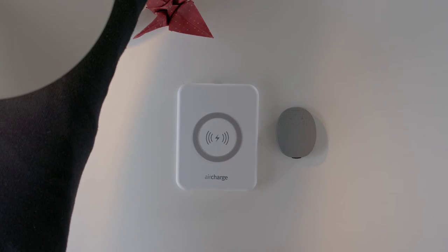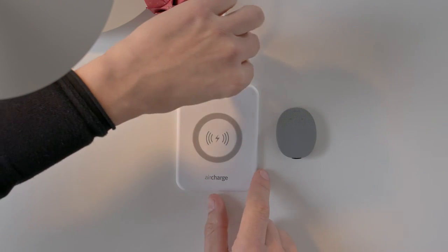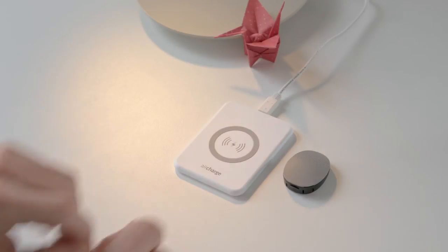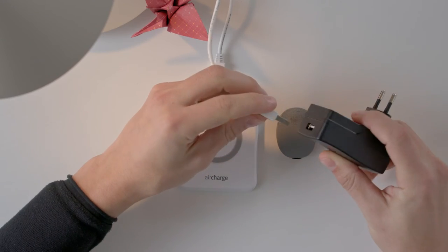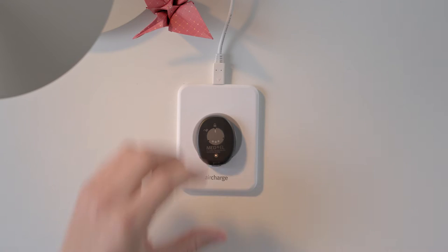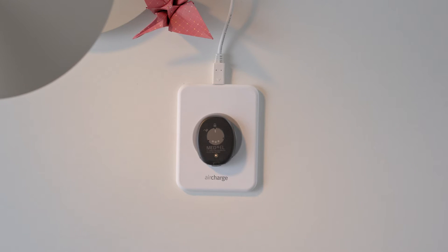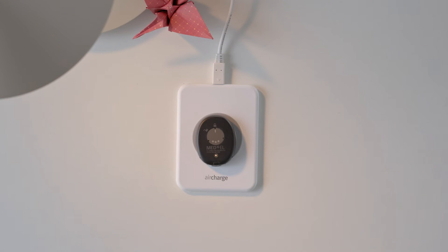To start charging RONDO 3 wirelessly, plug the USB cable into the charging pad. Plug the other end into the wall plug adapter or into a USB port. Place the RONDO 3 in the exact center of the wireless charging pad with the MEDAL logo facing upwards. RONDO 3 will automatically switch off when placed on the wireless charger. The orange charging indicator light on RONDO 3 will illuminate while it is charging.